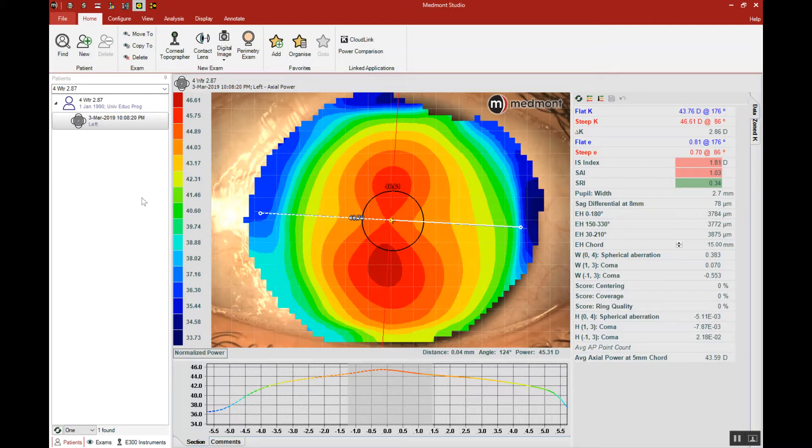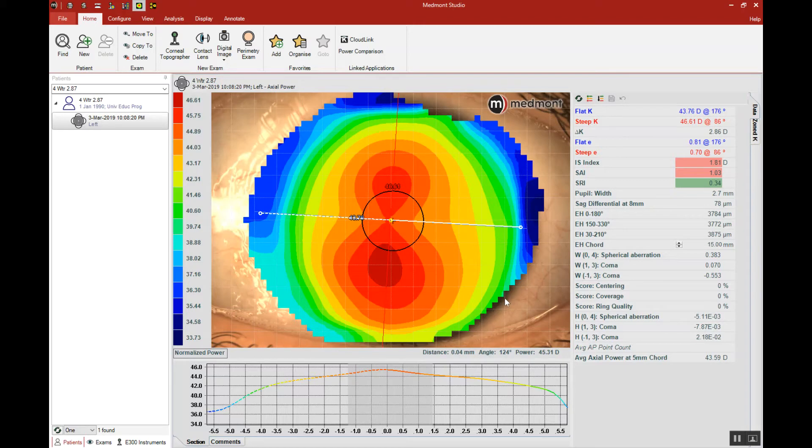A single Medmont topography will give us an incredibly large surface area of capture, but it might be advisable to use the composite capture feature which fills in all of the peripheral corneal shape information and gives us virtually limbus to limbus corneal data.